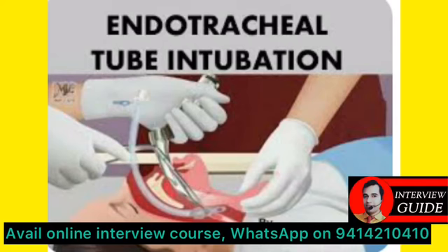After confirming, we put the tape and properly secure the tube at the mouth. After taping, we again check the tube position by all the methods I have told before, that is, saturation and auscultation. Lastly, we can also ensure the tube is in proper position by taking a post-intubation X-ray, so that we can see on the X-ray that the tube is in the proper position.